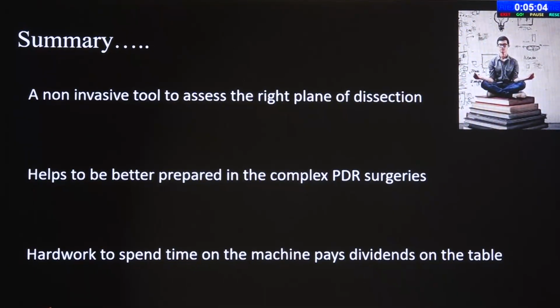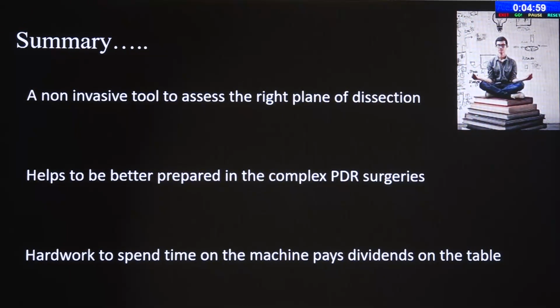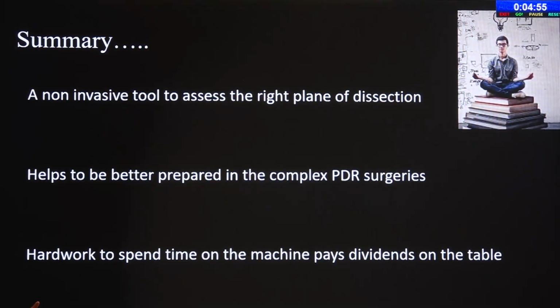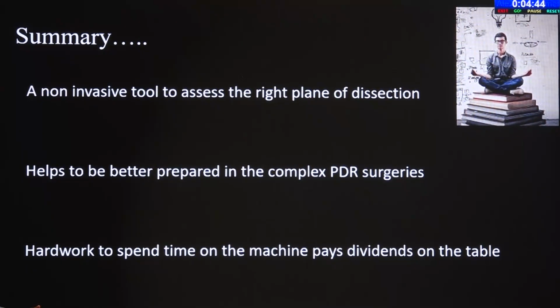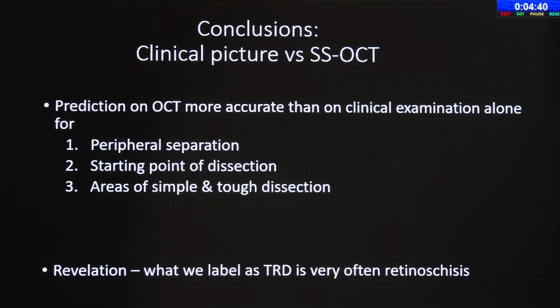So to summarize, OCT is a completely non-invasive tool. You don't worry about patients with nephropathy, etc. You can use it multiple times to assess the right plane. It helps us to be better prepared. You need to spend a little hard work. I think a lot of credit to Dr. Cyrus, because he spends a lot of time before every case to see the OCT. Sometimes the young surgeons, we just say whatever is on the table we're going to tackle, but I think it's a good way to do it.